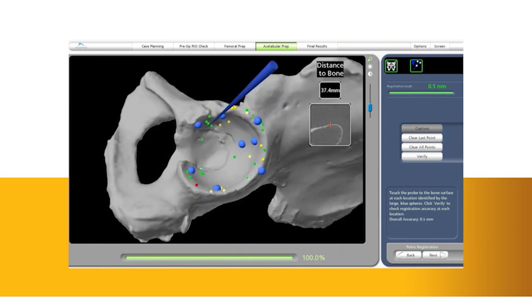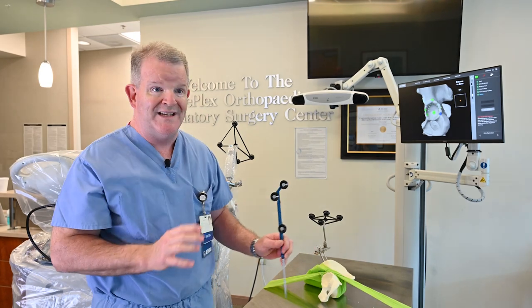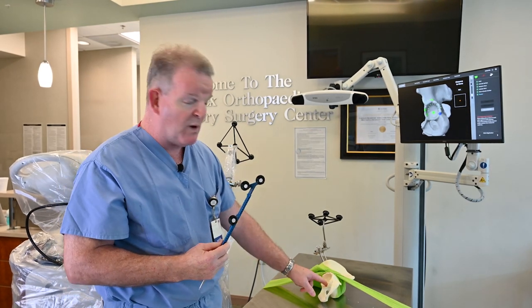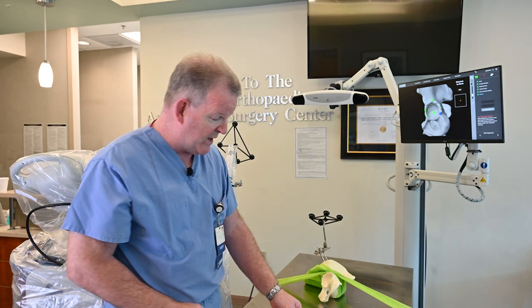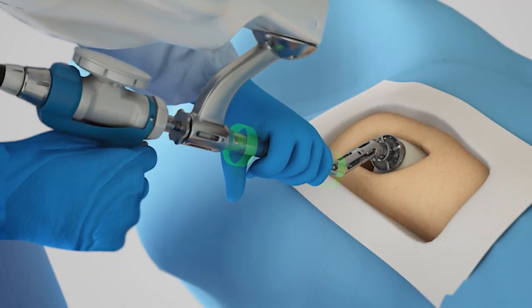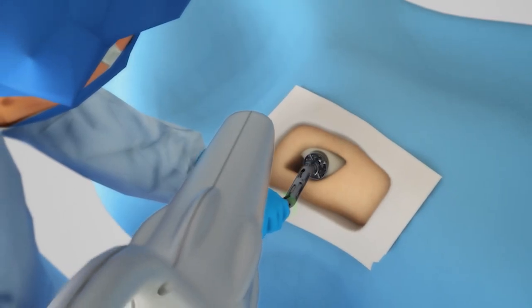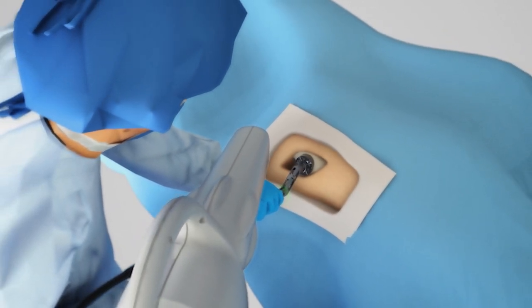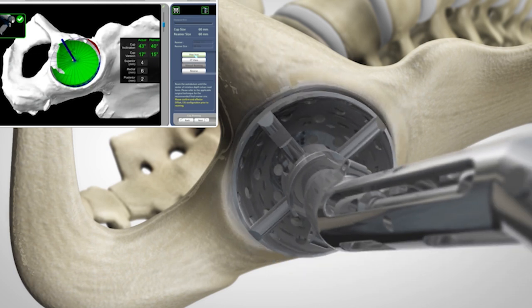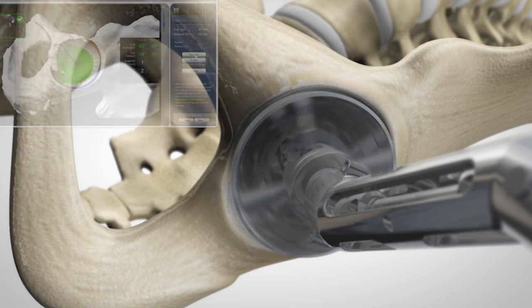Then what we do is we map out the entire acetabulum, and you can see right there all the little dots that we get to map out to confirm with the CT scan what we got preoperatively with what we're seeing in real time in the operating room. Then what this allows us to do is bring in the robotic arm and prepare the cup in a way that is so precise that we can get it down to the exact angle and position that we want it. So nothing else can give that kind of accuracy. I can position the implant exactly the way I want it.